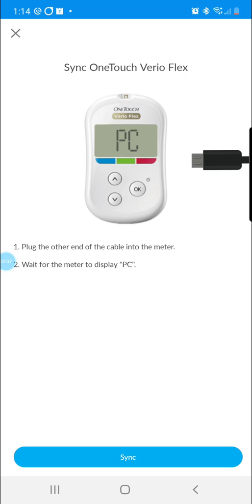Now that your OneTouch meter is synced with the Gluco app, the data will automatically be sent to your provider every time your meter is turned on and connected via the cable to your Android.